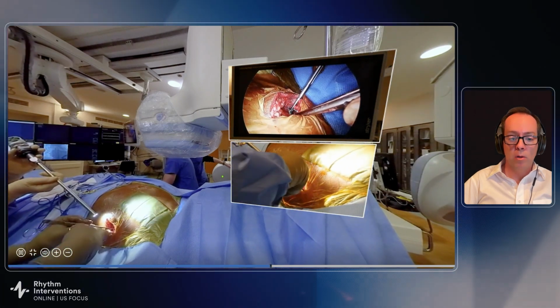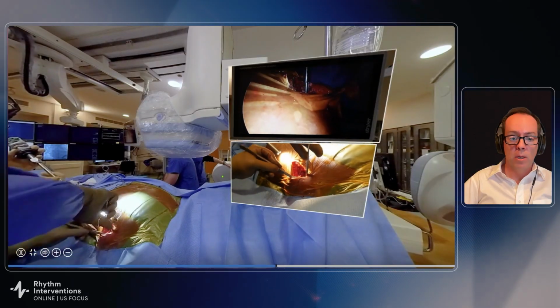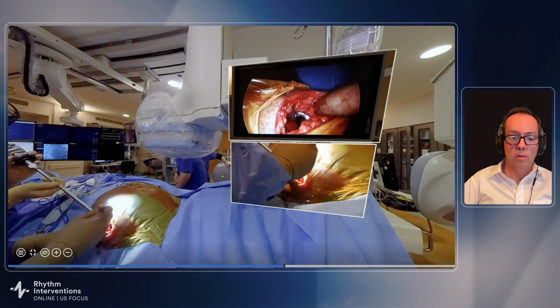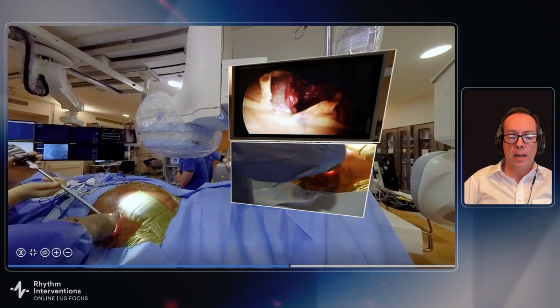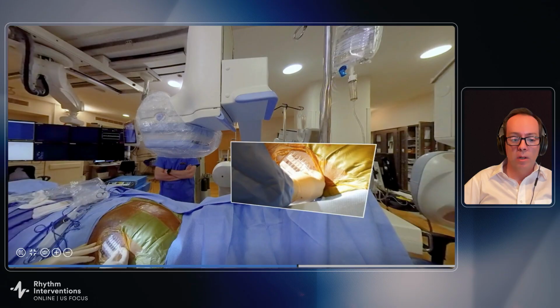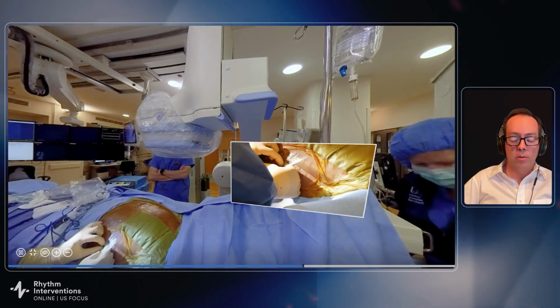He's using a smaller radius needle and a small gauge absorbable suture for the muscular closure, trying to approximate the serratus to the latissimus dorsi. I have found a much faster approach is a large radius needle with Vicryl and locking mattress to run that.